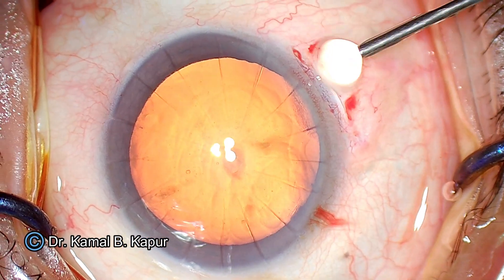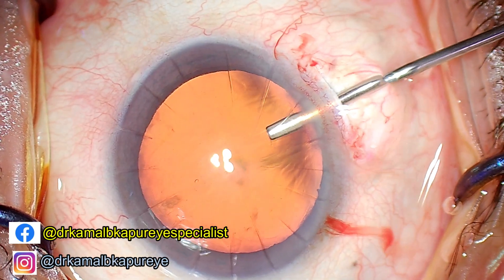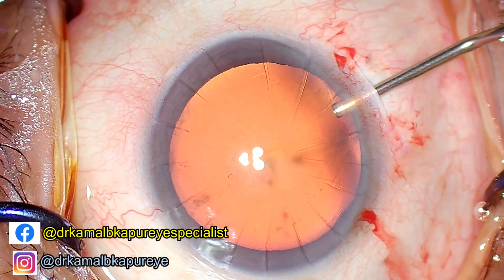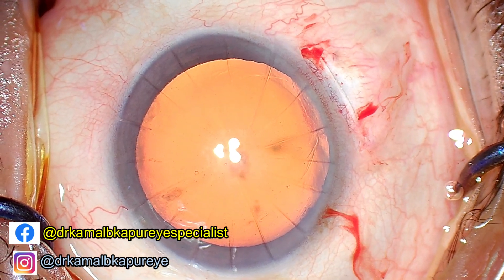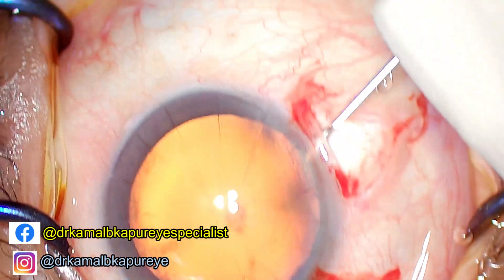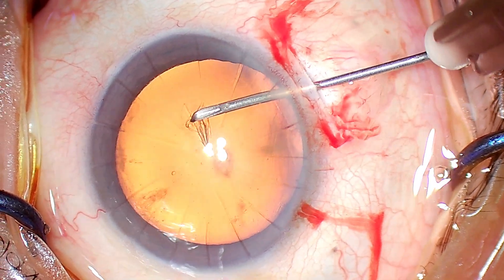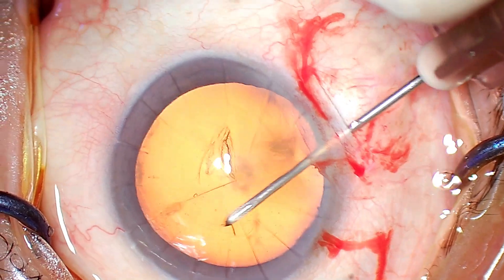You will notice that the scleral tunnel is very beautifully created — a linear scleral tunnel going straight into the cornea. Now we inject viscoelastic, making sure there is good adequate distension of the anterior chamber, but not over-pressurizing. The entry of the cystotome is done in a lying-down manner because this may cause Descemet's detachment if you don't follow this particular maneuver.